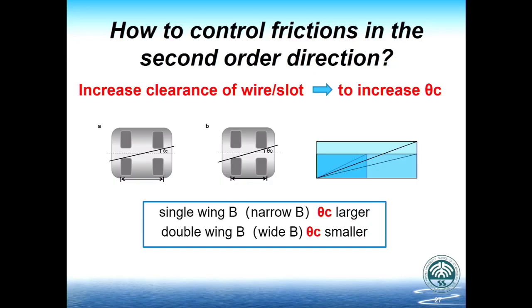And we don't usually change brackets to different slots in the middle of the treatment just to change the friction, just to change the slot archwire clearance. So that's why we don't usually adjust the slot of the brackets.